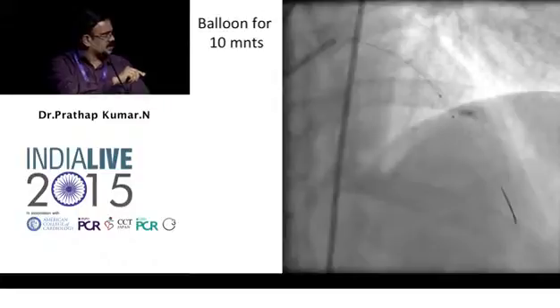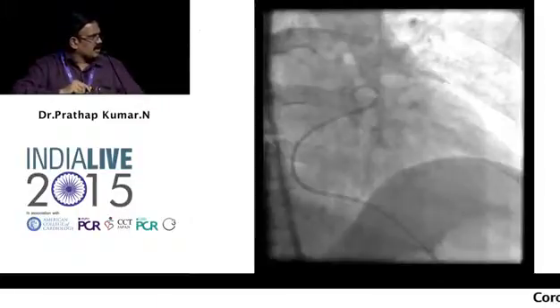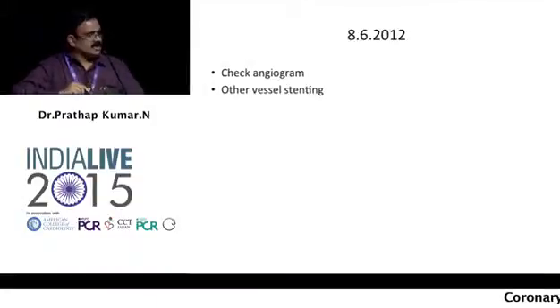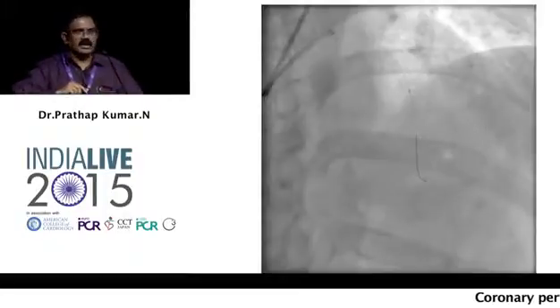Balloon inflation for 10 minutes. Nothing happened. I thought it was a contained perforation. Shifted the patient. After 3 hours, same thing happened. Check angiogram done next day. Perfect, other vessel stenting done.